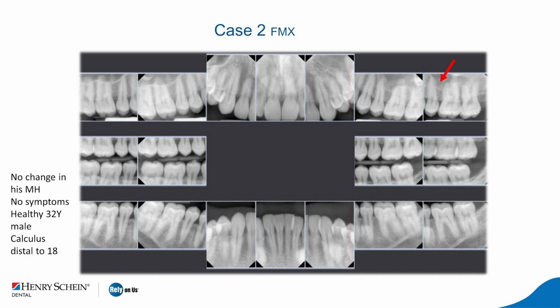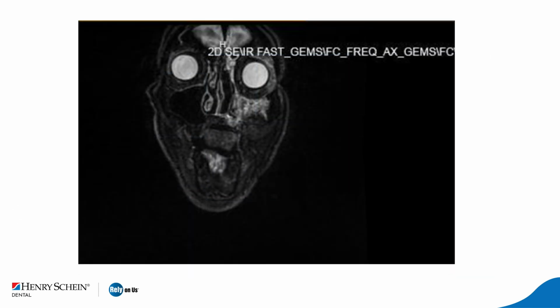When I give the presentation, I always have one hand raised in the crowd, and the doctor is asking me, well, if the patient had a sinusitis, for example, would that be the same image? Well, no. The floor of the sinus will still be there, even if you have acute or chronic sinusitis. Those structures never disappear. They are there. You will see opacification within your membrane. You'll see mucoperiosteal thickening, as we say, but the floor would still be there.